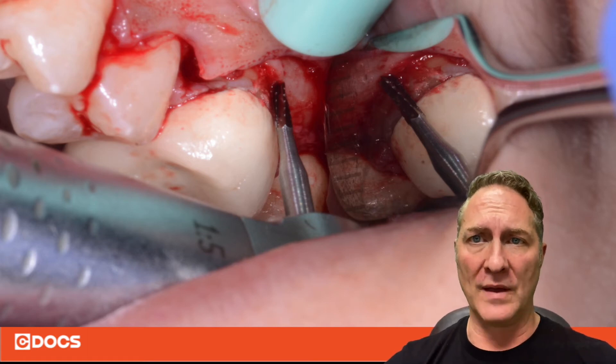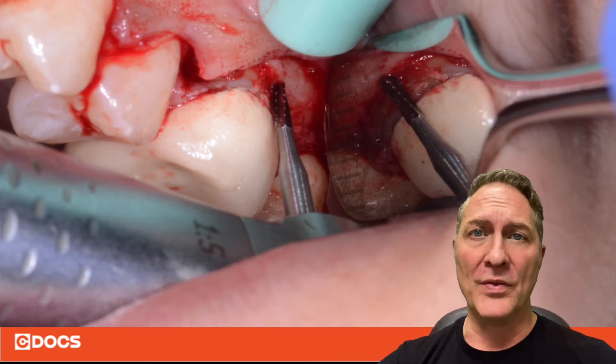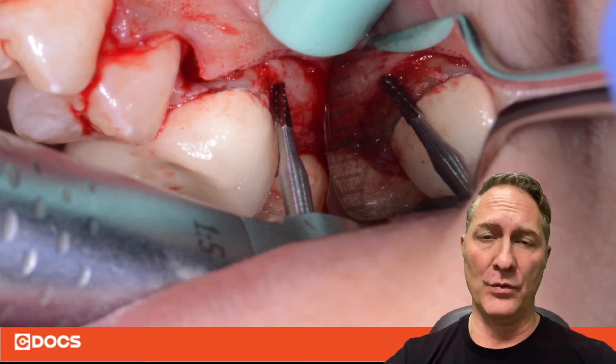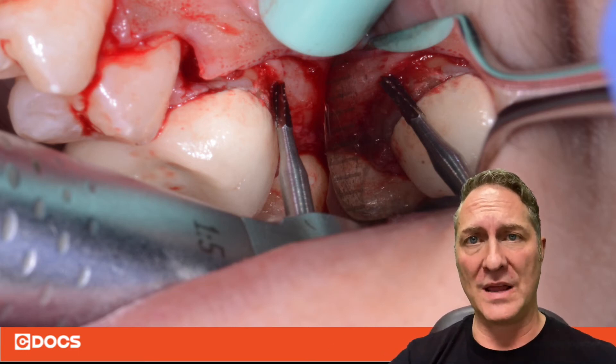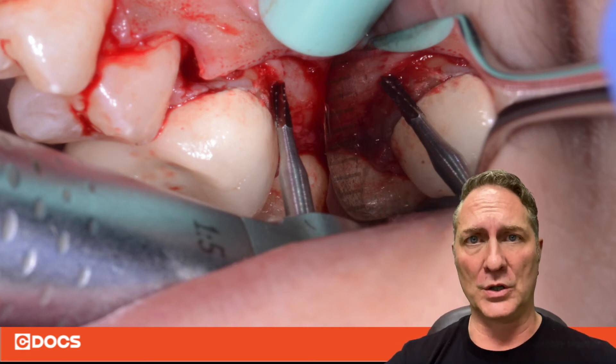And then you just work your way back lingually that way. There may still be some tissue or some tooth structure left at the very base of the furcation, but this gives you a good mark to know where you're at. From there, you can come down through the slot you've created through the tooth and remove the rest of that furcation. You'll know when you get through because tooth doesn't bleed, but bone does — so once you get through that tooth structure, the bone will start to bleed, and now you know you're in good position.